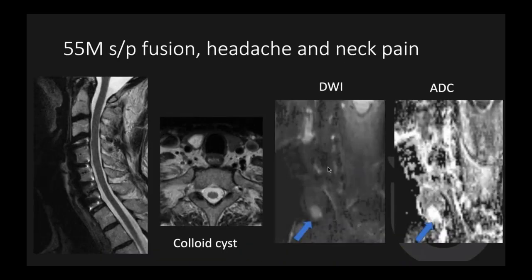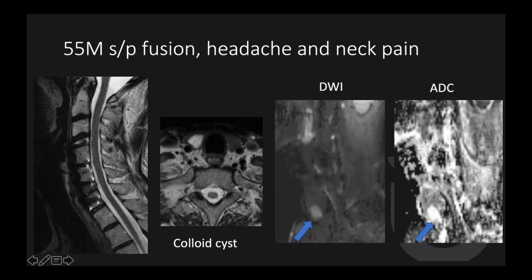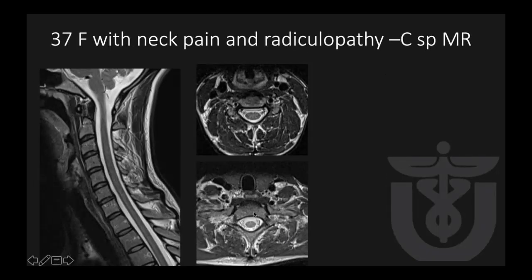This is a 55-year-old male status post cervical fusion. A thyroid nodule was found, but the good signs are: T2 bright signal, well circumscribed, no extrathyroidal extension, no lymph nodes. Diffusion was available and there is no restricted diffusion — if anything, facilitated diffusion. So these are benign lesions, likely colloid cysts.